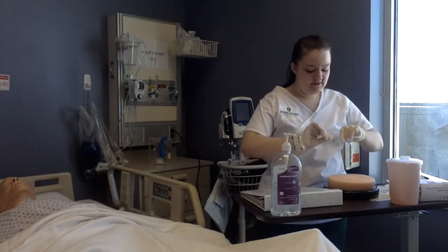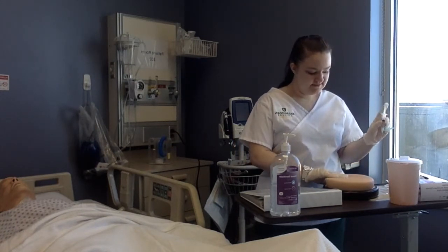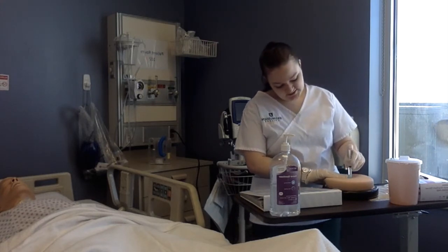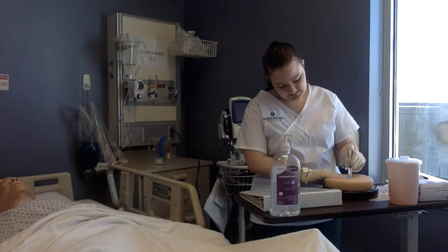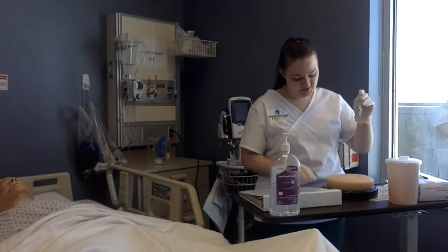I will then uncap my needle, Z-track the skin, go at a 90-degree angle. This is 2 milliliters, so it should take 20 seconds. So I begin injecting, not too quickly. After 20 seconds, I would then remove my needle, the same degree it went in.